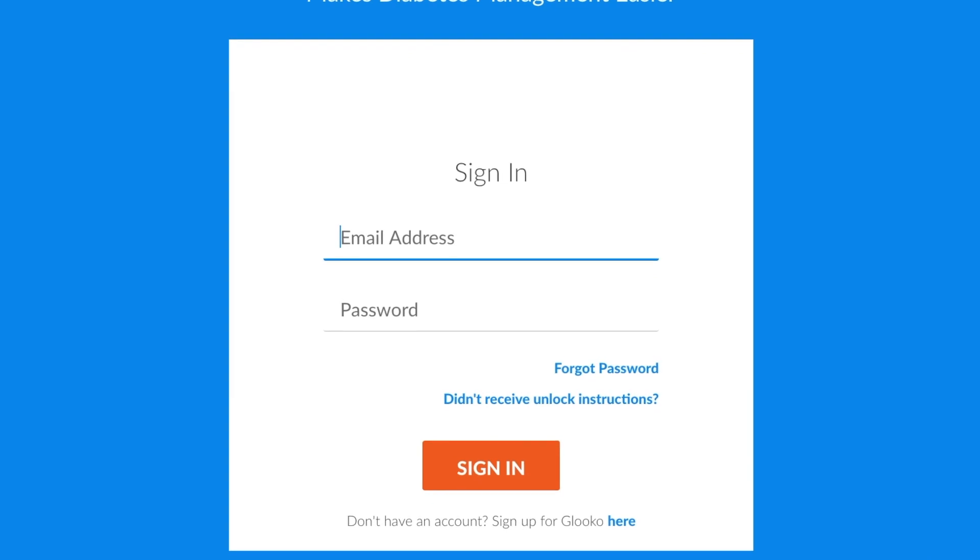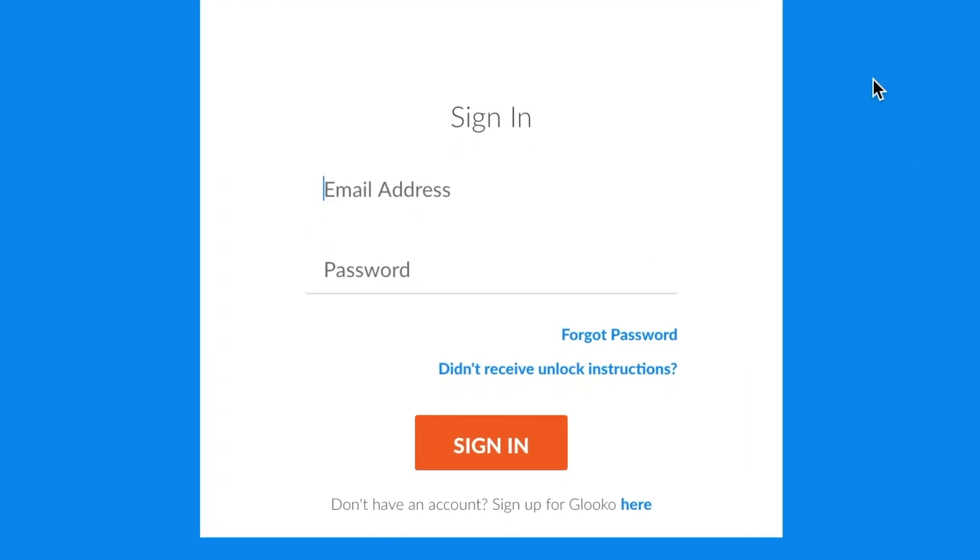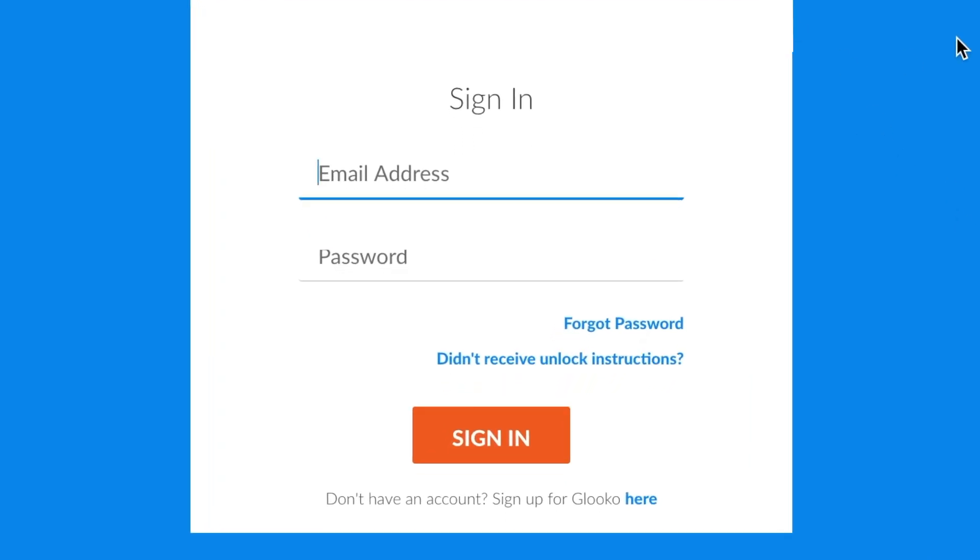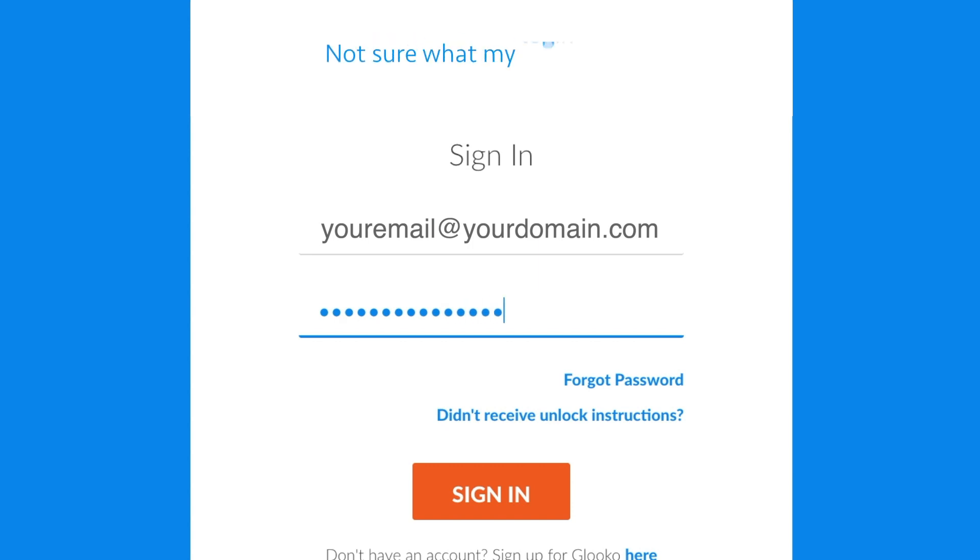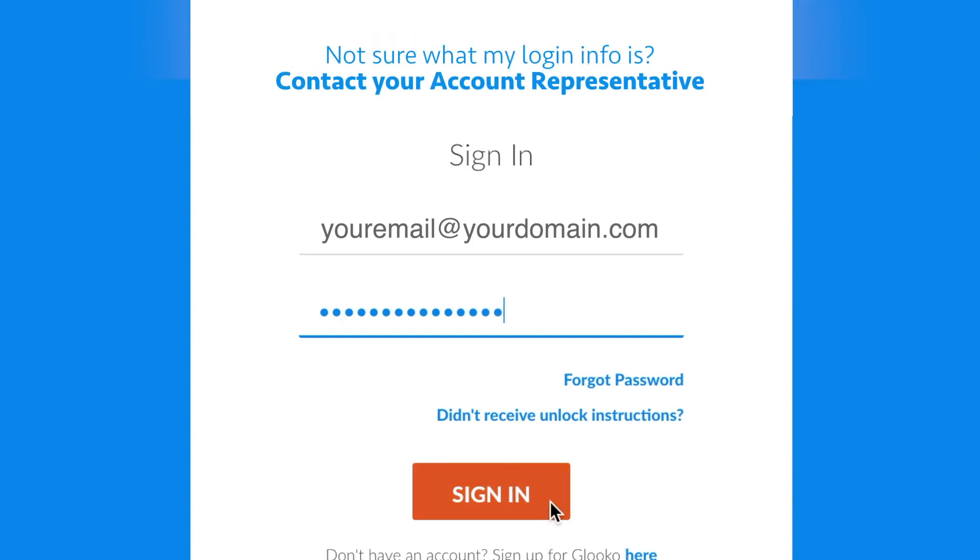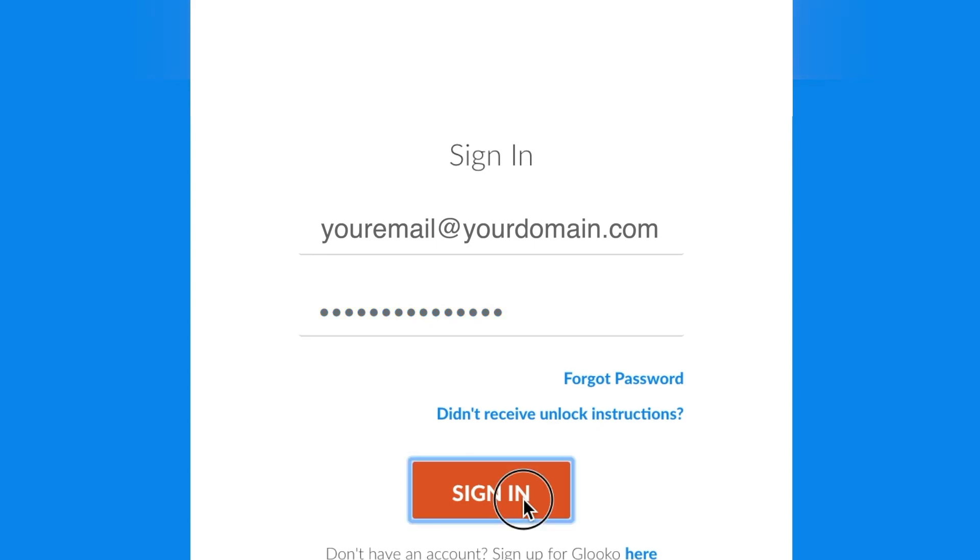You'll see that'll take you to a blue sign-in page. From here, you just want to go ahead and enter your login credentials. So that would be your full email address and whatever your password is.